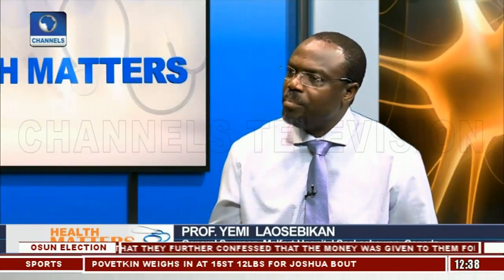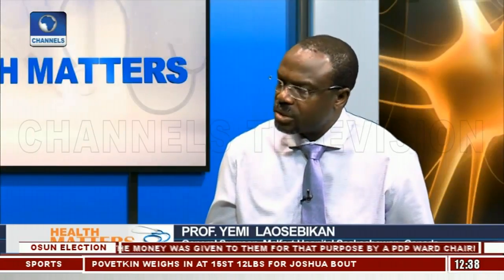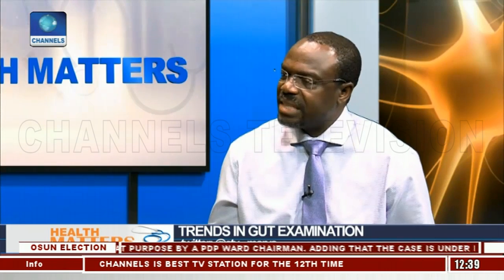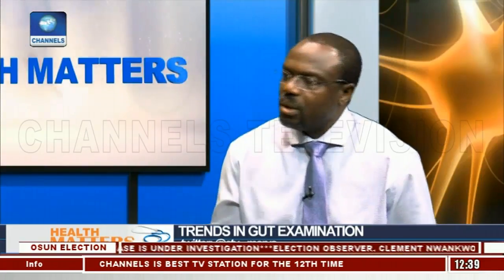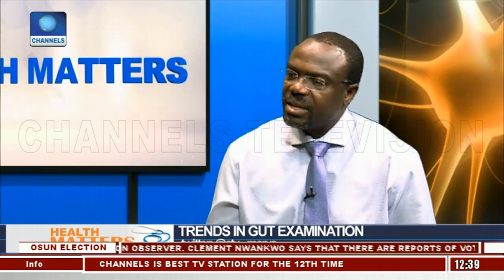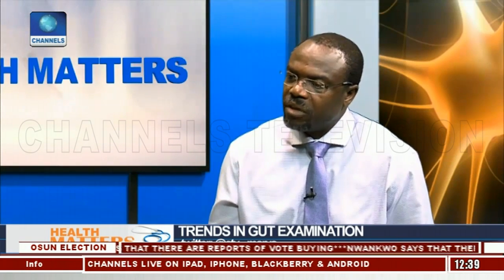So that is one of the benefits to the individual patient. It also saves you the pain of invasion from an incision. So we go through a natural orifice. So it's less invasive. Less invasive and more comfortable in the long run for the individual.